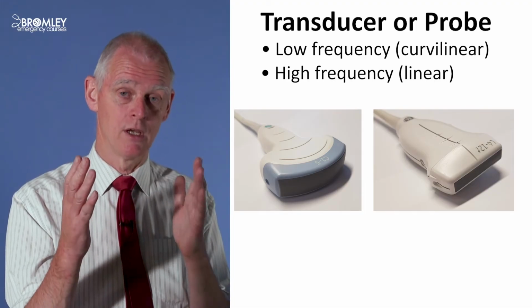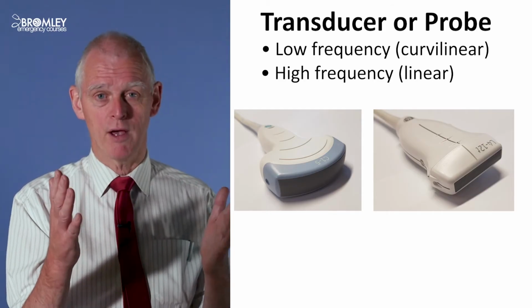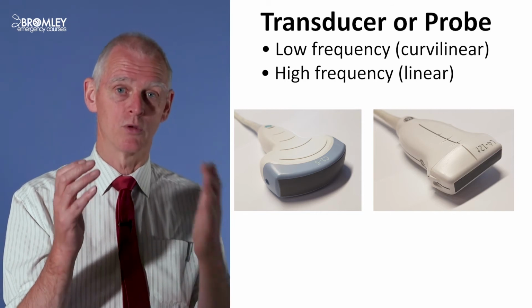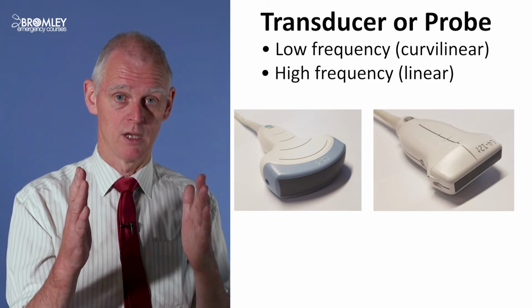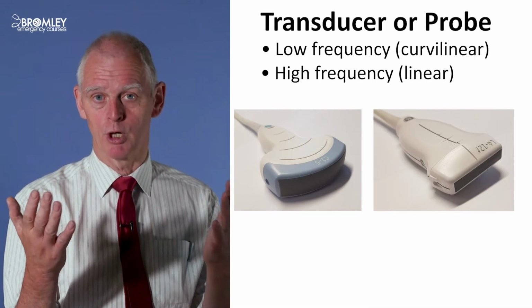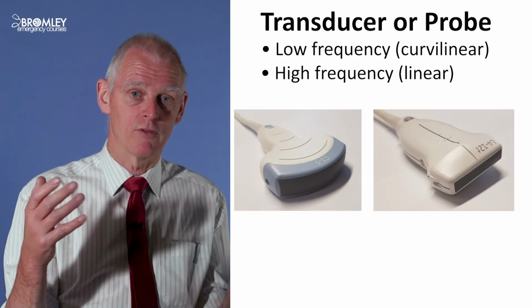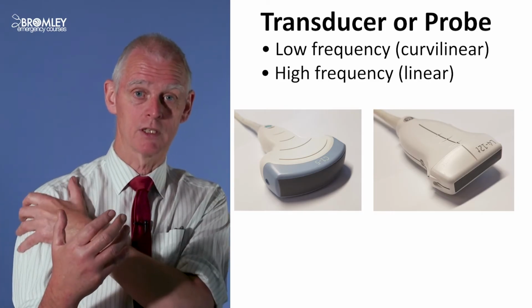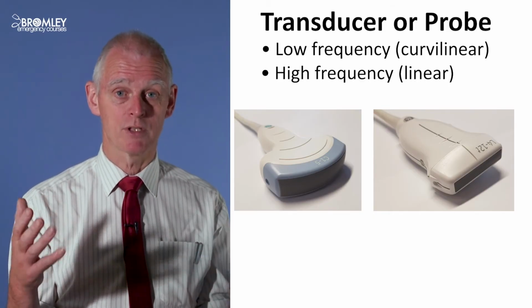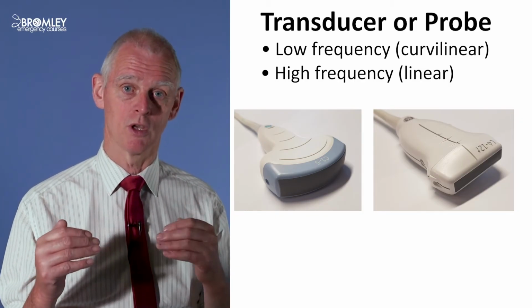Penetration is much less. And generally speaking, we're going to use the linear array for a few centimeters, maybe 5 centimeters from the surface. They will often go to 10, but it's usually used for 1, 2, 3, 4 centimeters from the surface. And it gives a great deal of detail. It tends to be called the vascular probe because that's what it's been most known for. But it's also used for musculoskeletal, for ligament tears, rotator cuff tears, Achilles tendon tears, for foreign bodies, for abscesses, for pneumothorax assessment, etc. A number of other surface uses that we use the linear array for.